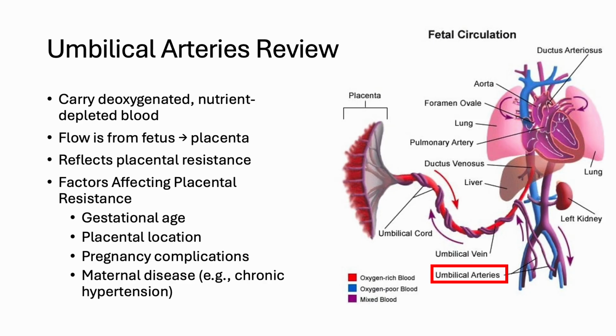Remember, it carries deoxygenated, nutrient-depleted blood flow from the fetus to the placenta. Factors that affect placental resistance are sometimes normal, like gestational age. It can be impacted by placental location, pregnancy complications, or maternal disease like chronic hypertension.